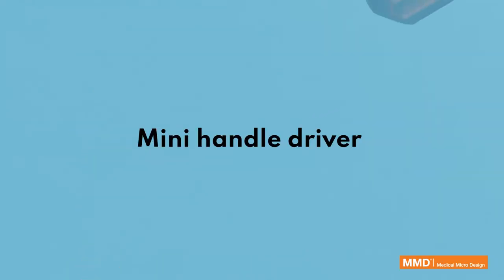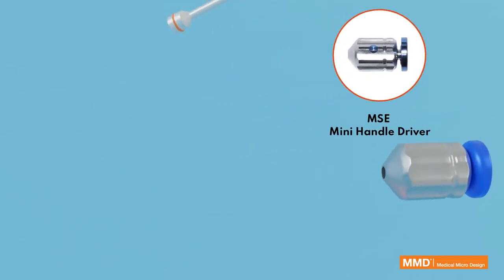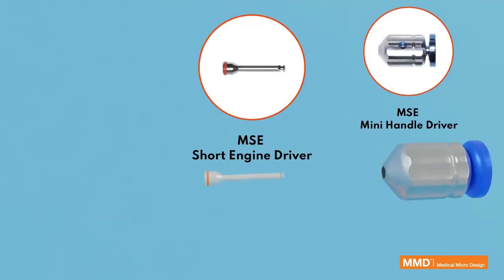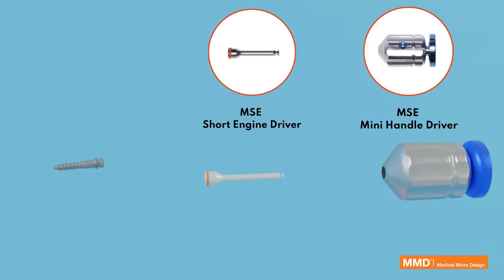Mini-handle driver. MSE mini-handle driver. MSE short engine driver. Miniscrew.